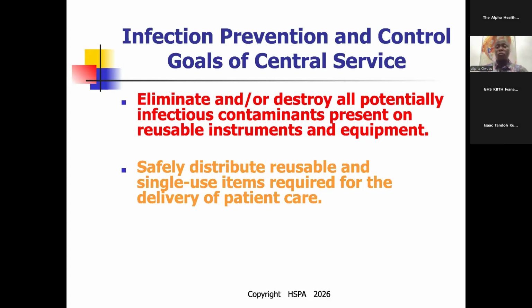By so doing, we have to go back to the FDA and report all these things to them, because probably, the sterilant that the FDA has approved might not be compatible with the process of reusing it. So we have to look at all these things, making sure we distribute these reusable items without cross-contamination or event-related problems, distributing them with efficacy and maintaining sterility, making sure that we are saving patients.